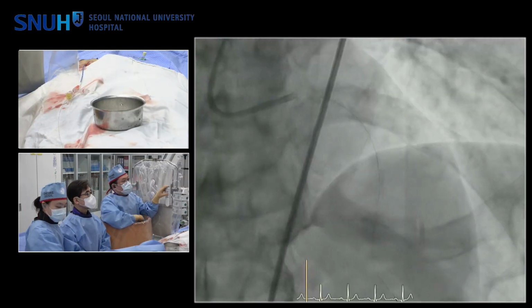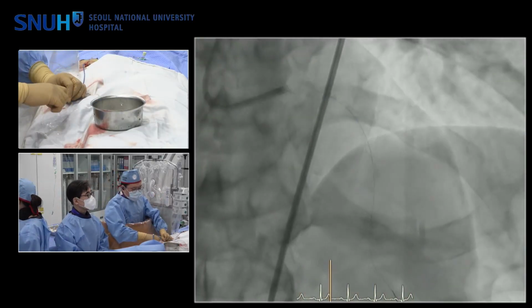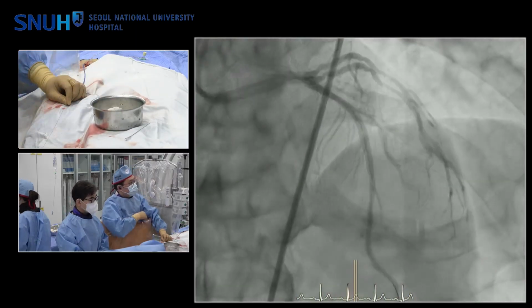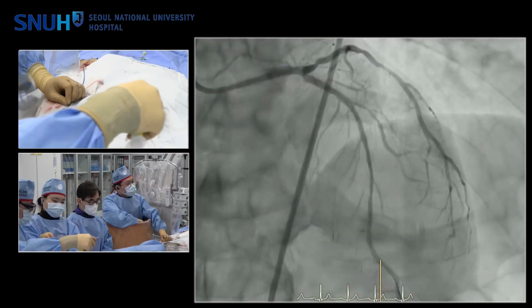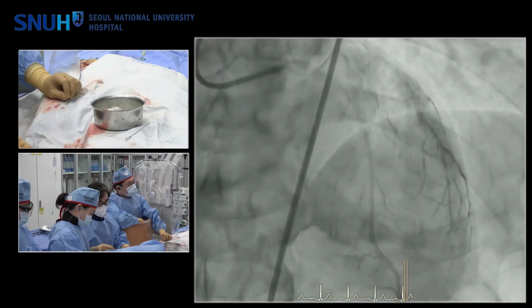In this case, in the distal left main, when the lumen is 5.9, I think IVL has minimal effect in the eccentric calcium nodule in that location. So I think IVL can't do everything, but it's definitely helped the ease of doing work, and therefore the use case will increase gradually, I think, in Korea as well.